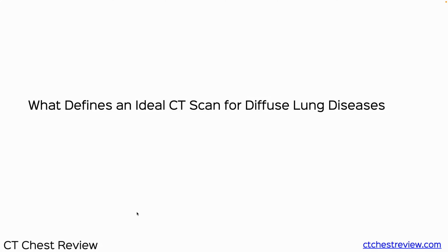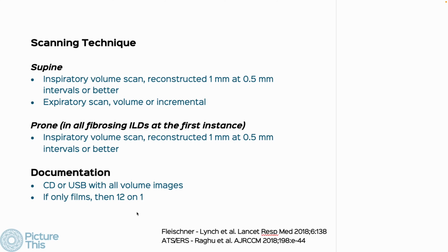This is Dr. Bhavin Jankaria, and today I'm looking at a topic which I thought I had done earlier, but I've done only in bits and pieces. And so I'm putting this together as a small snippet that is titled What Defines an Ideal CT Scan for Diffuse Lung Diseases.